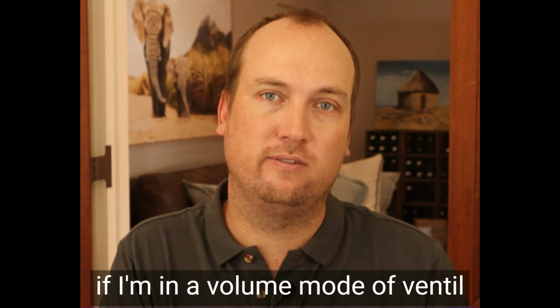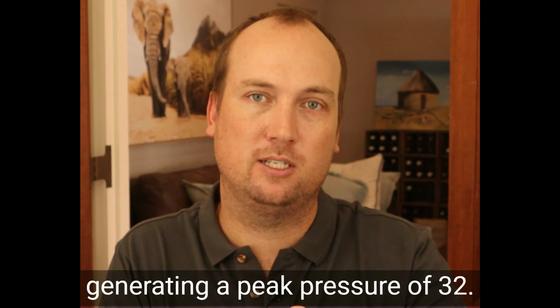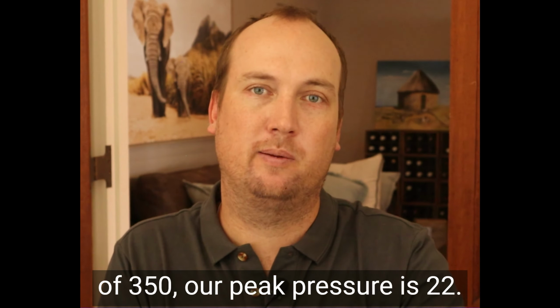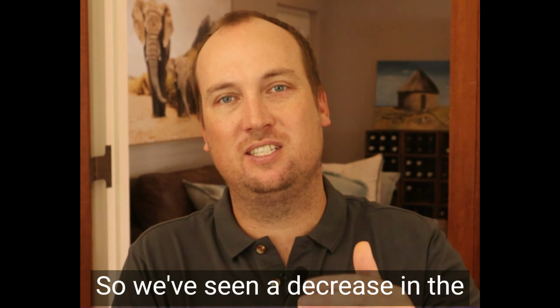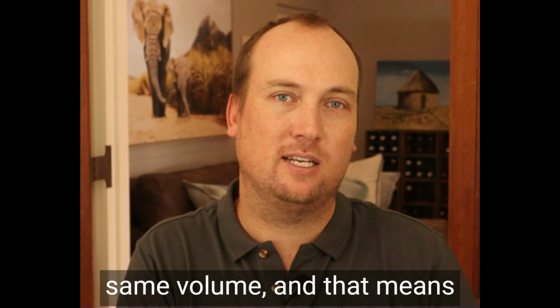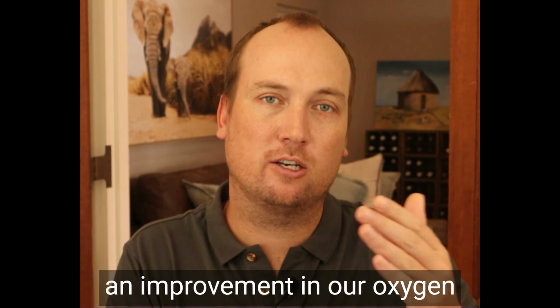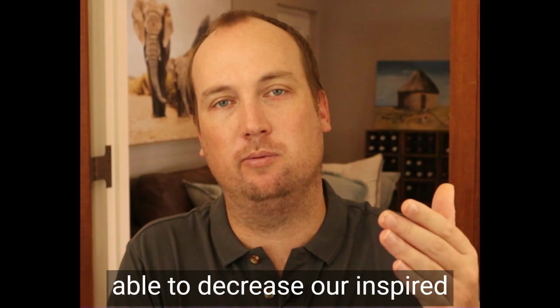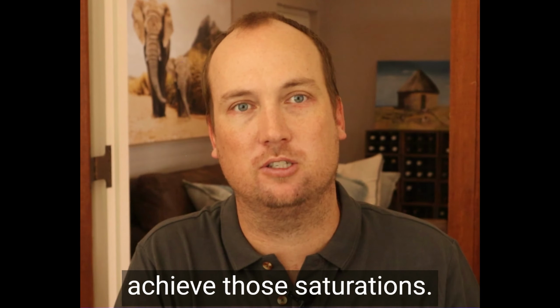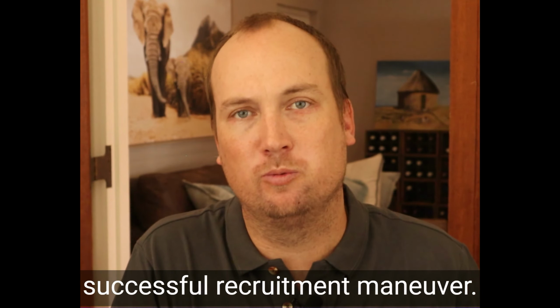If I'm in a volume mode of ventilation, that 350 mil volume was generating a peak pressure of 32. Now, when we deliver a volume of 350, our peak pressure is 22. So we've seen a decrease in the pressure required to deliver that same volume, and that means our compliance has improved. What we should also see is an improvement in our oxygen saturations, and we should be able to decrease our inspired oxygen concentration to achieve those saturations. So that would represent a successful recruitment maneuver.